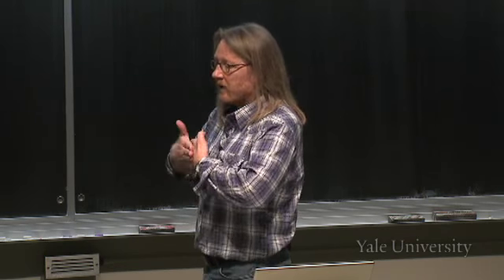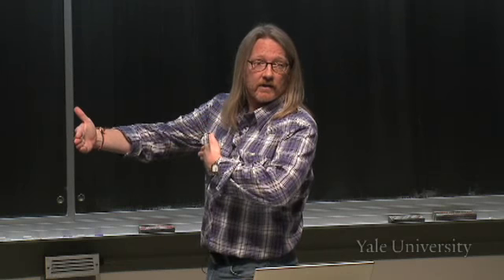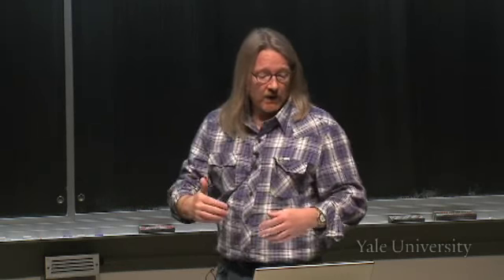Sarah? Yeah, you could ask the patient to turn to the side, and you could then do the same measurement this way, right? And now you'd see another projection, but you see a projection from another angle. And so you would be able to differentiate what is different in this direction, right? And you might do it obliquely. You might ask the patient to turn a little bit sideways, or turn the other way. And by putting together several different images taken from different angles, you can learn more about the three-dimensional aspects of what's inside. You might be able to see things that you can't in one image in one of the other angles.